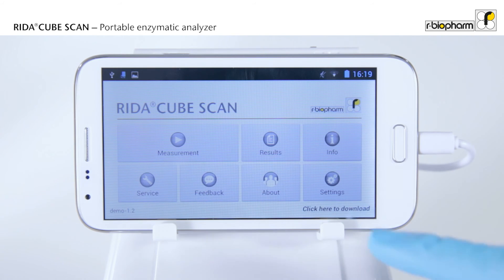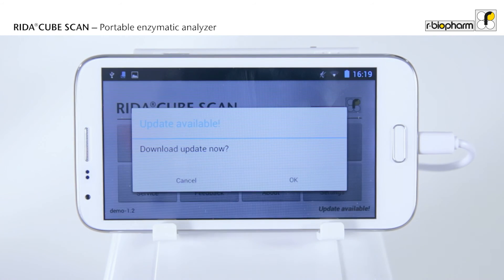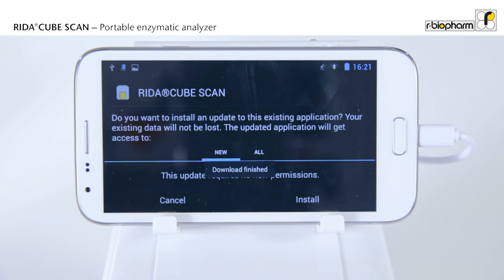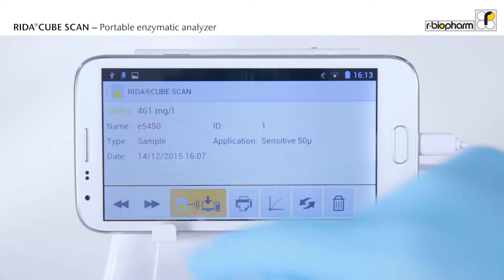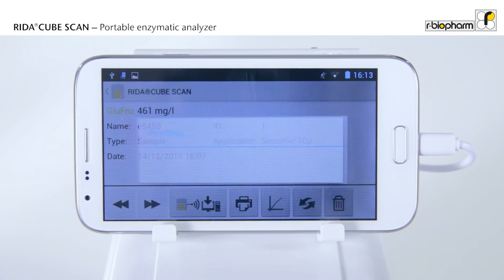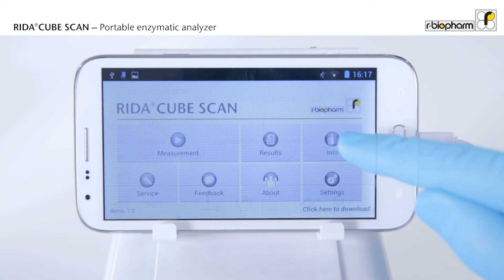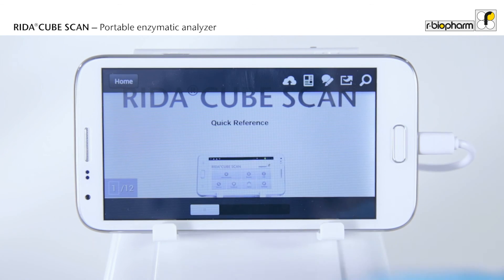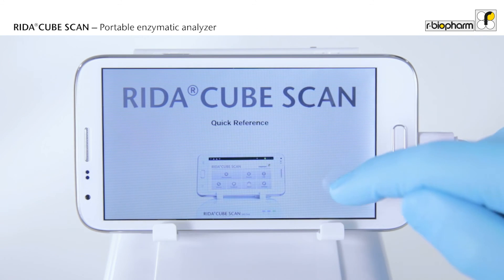Enjoy full convenience by connecting your tablet to the network via Wi-Fi. Get automatic updates for the app. Send your results via email, print them, or export them directly to the LIMS. The app also delivers useful background information, like the manual and the reagent instructions.